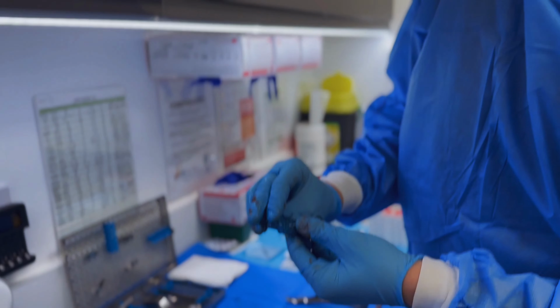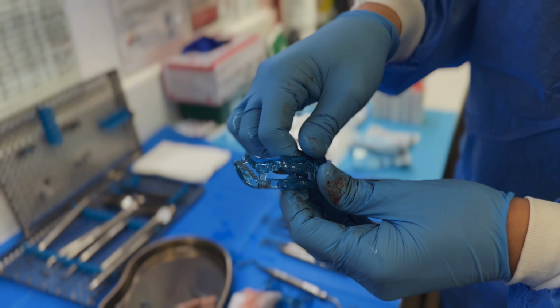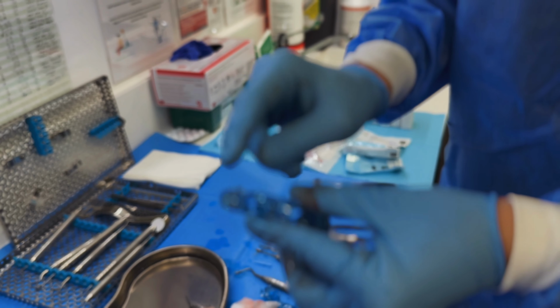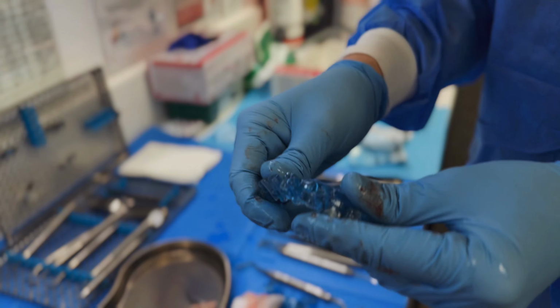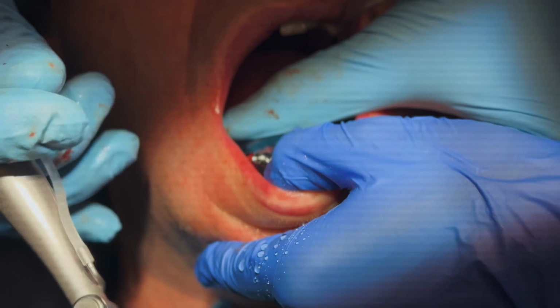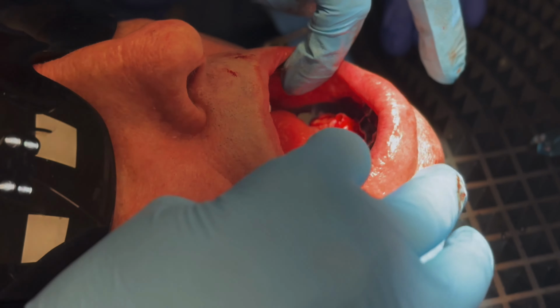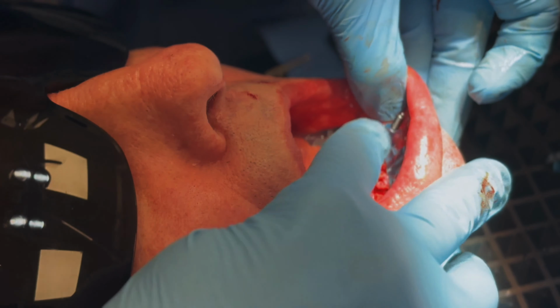So this is the lower guide, bone supported guide. So this sits on the bone and we secure it with 4 pins, which we'll show you now. So we're placing the fixation pins to secure the guide, and we've got one more. Okay, John? Okay, yeah? You feel any pain? Yeah. No, okay.